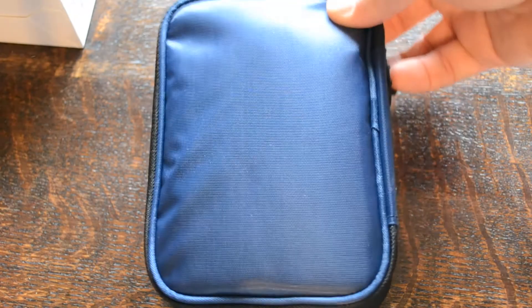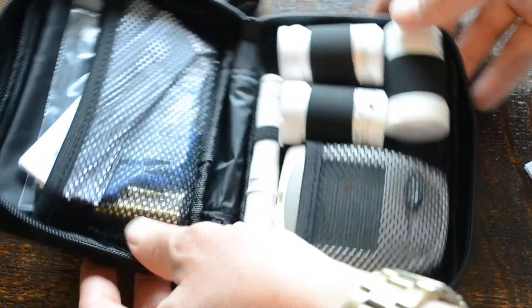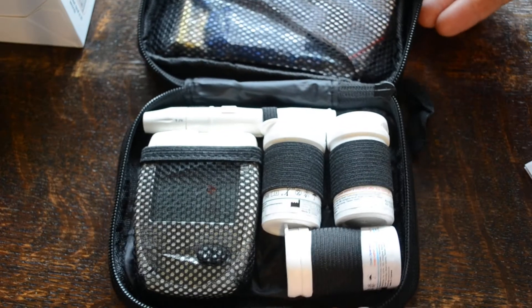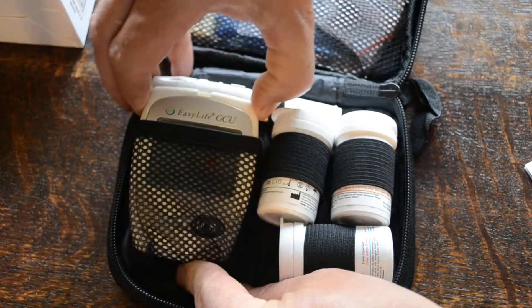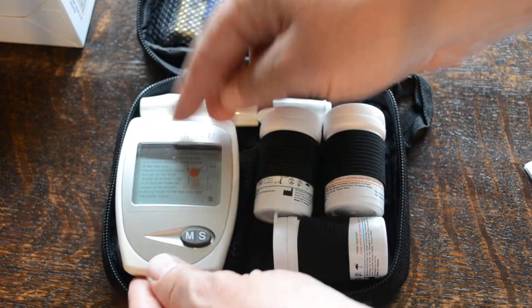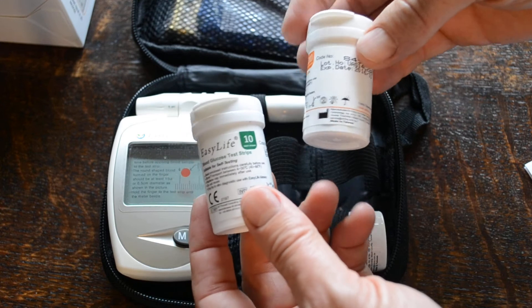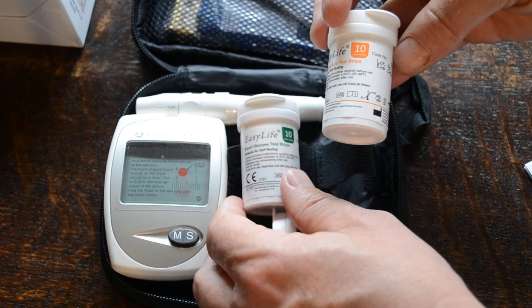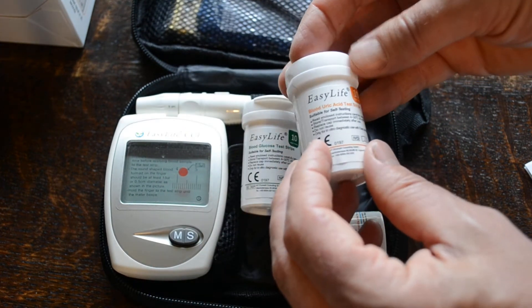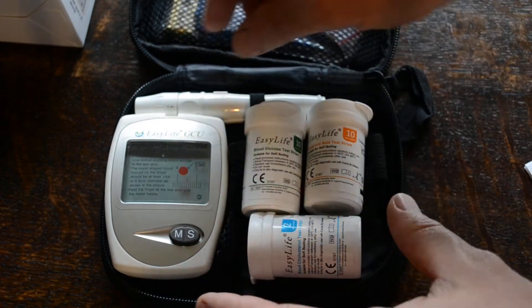The meter system comes — here are the contents, this is what you get in the pack. A storage pouch which is a zipper pouch with everything in it, and in here you have a digital meter, three sets of test strips to get your testing started: 10 glucose test strips, 10 uric acid test strips, and two of the cholesterol test strips.